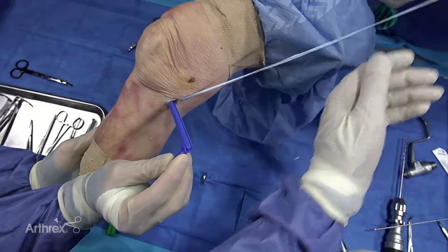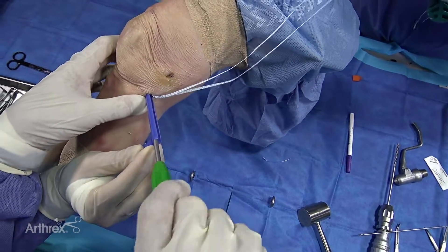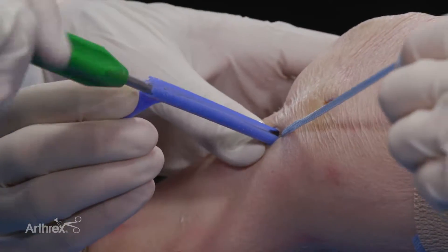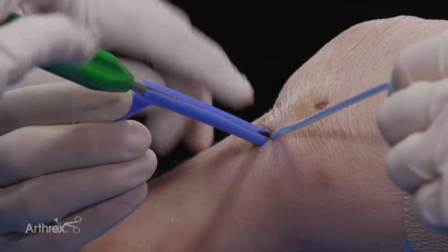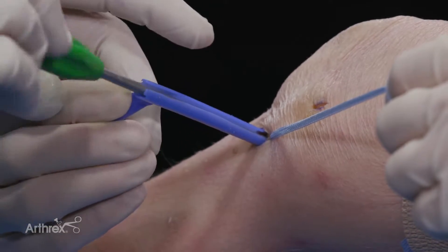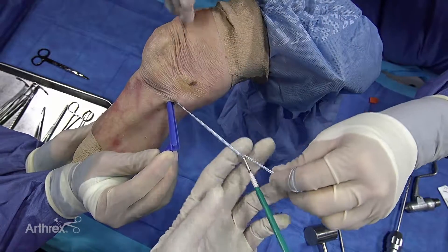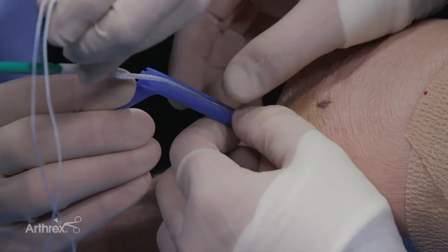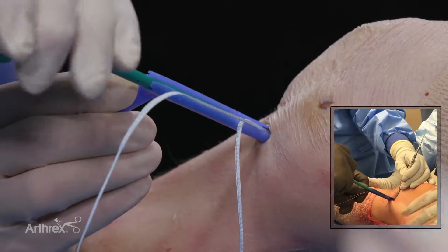While he's loading that, I'm going to use my tap. You've got to tap these holes because distally, especially distally, they're really hard bone. Fully tap it. Now he's holding this — this is the most important part of this case because he's really holding that. What we do is we're going to take this and we're going to slide it right down the slot. See the slot right there? Slide it right down the slot and tap it just a tiny bit to get it in and start it.